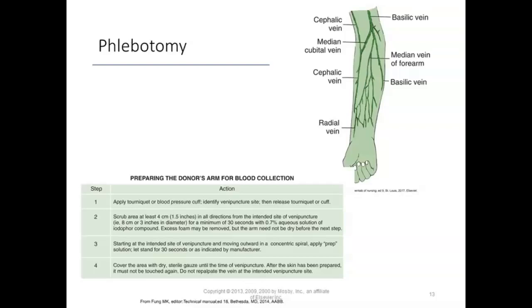Like I said, it's bigger, so the blood can flow a lot better. And remember, you're trying to give out 500 cc's of blood, so you need to have a good blood flow for that. From the time that the donation starts, it should take about 8 to 12 minutes.